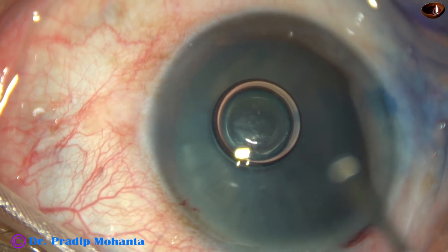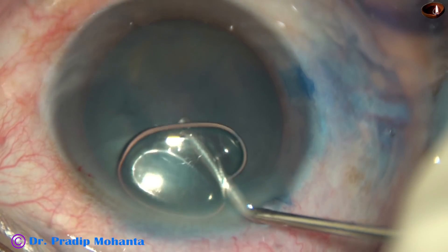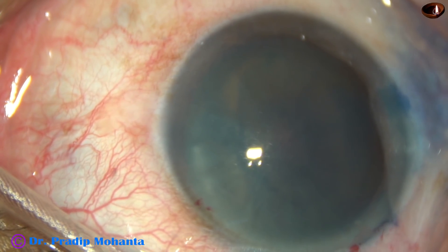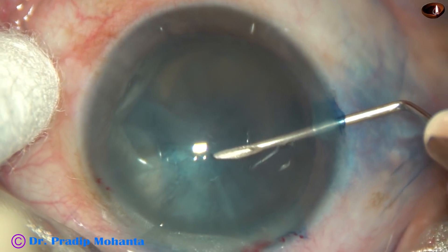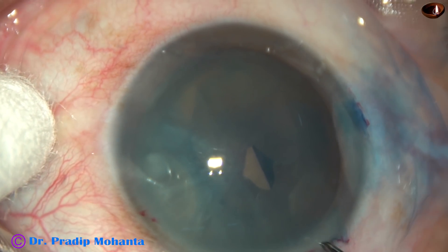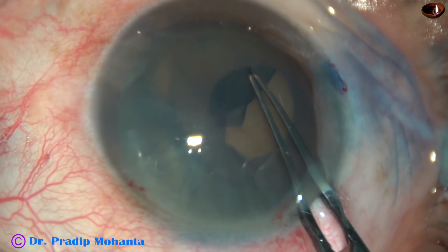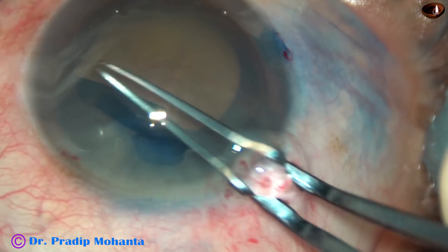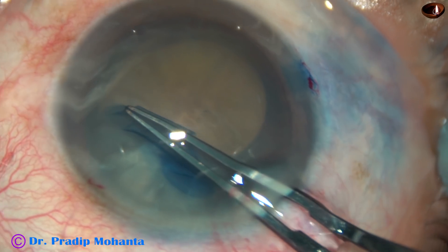And now, 2% HPMC is injected into the anterior chamber. And now, see what happens as I make a puncture onto the anterior capsule. Here it is — no fluid comes out. So this is not an intumescent cataract. There is no positive pressure, but there is convexity of the anterior surface.